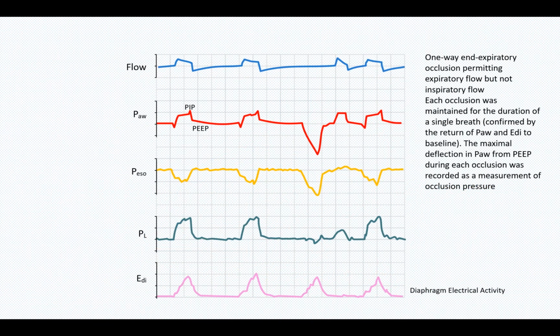And in the previous ventilator round, we talked about the end expiratory occlusion test. And we said we're going to occlude the airways at end of expiration.